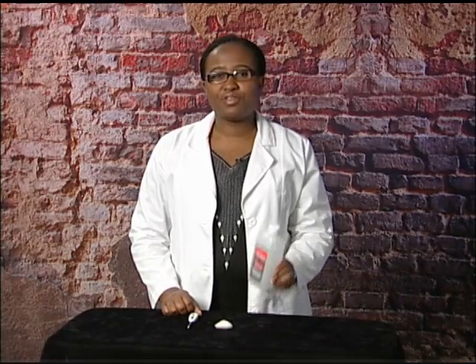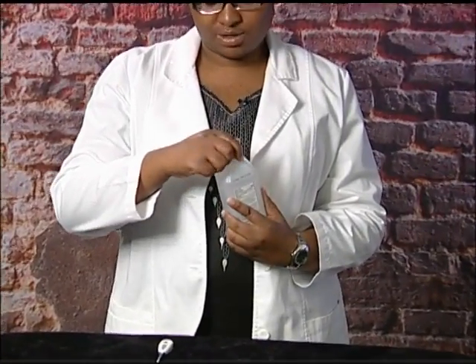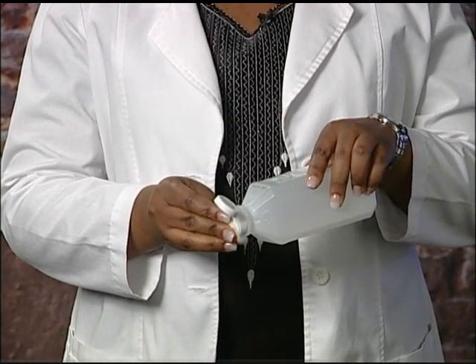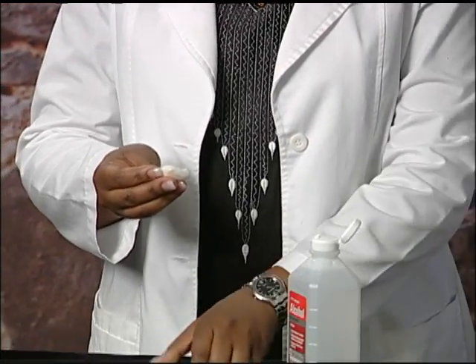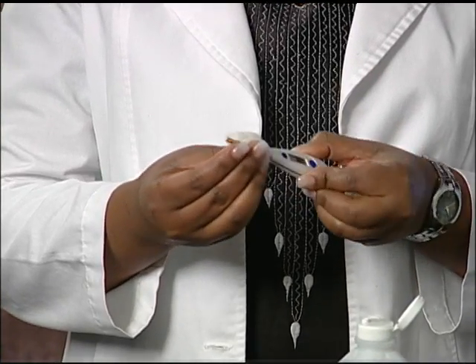Another way of cleaning the thermometer is by using alcohol. Take a clean cotton swab and soak it with alcohol. You can also use a towel for this. Then rub the end of the thermometer with your cotton ball.